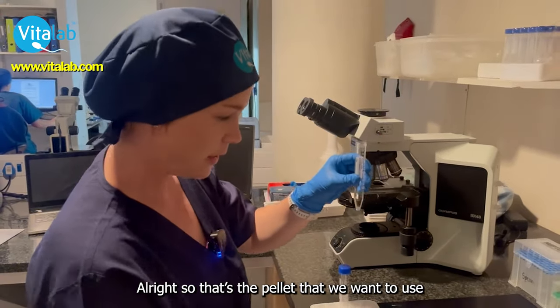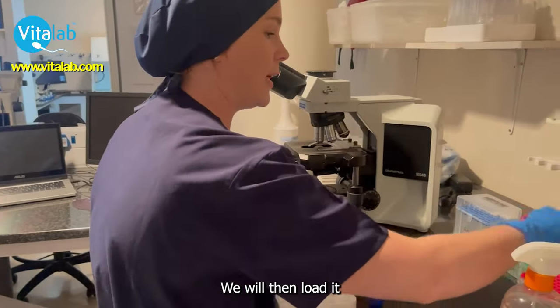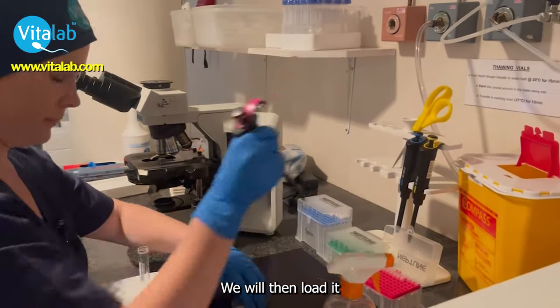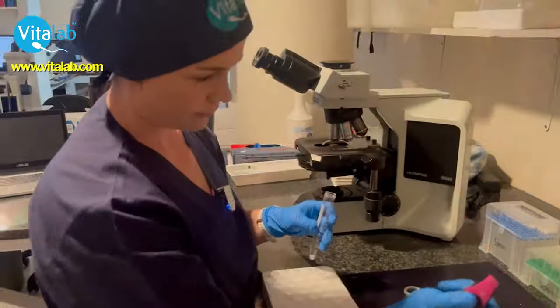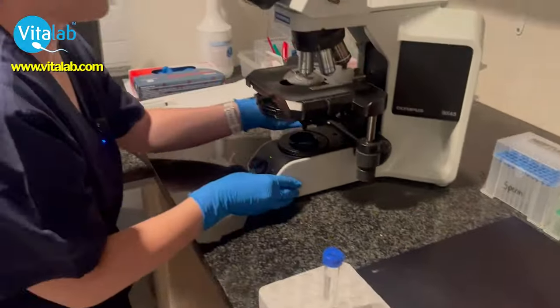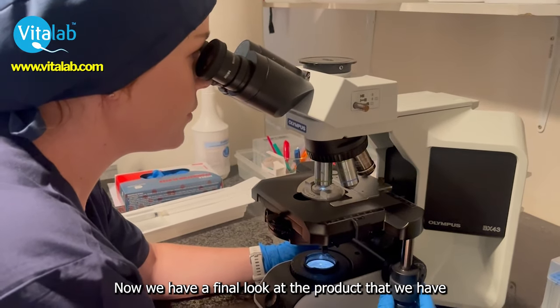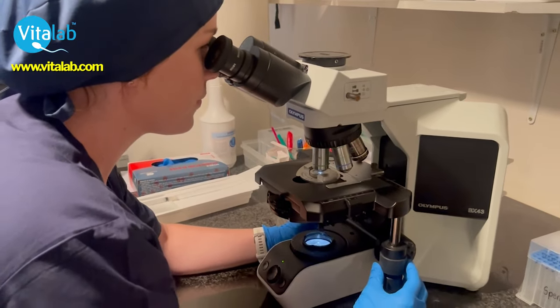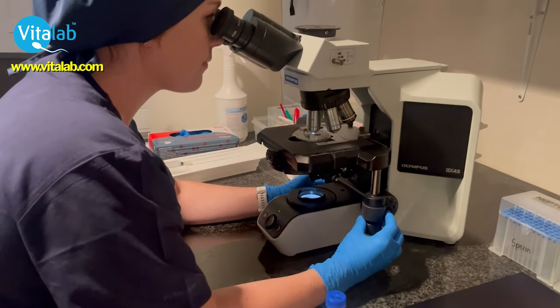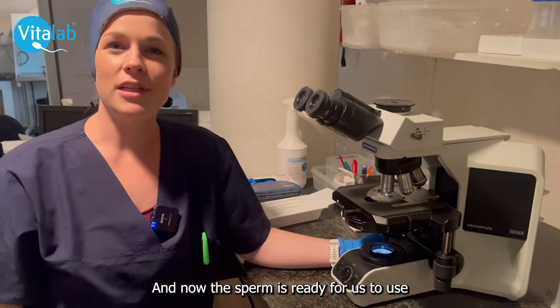So that's the pellet that we will be using. We will then load it and count the final product that we have. And now the sperm is ready for us to use.